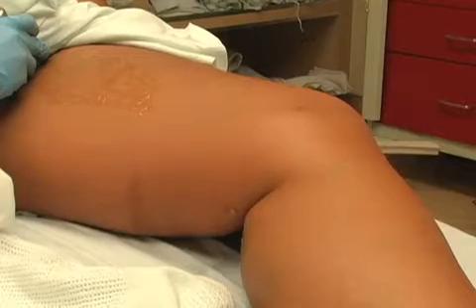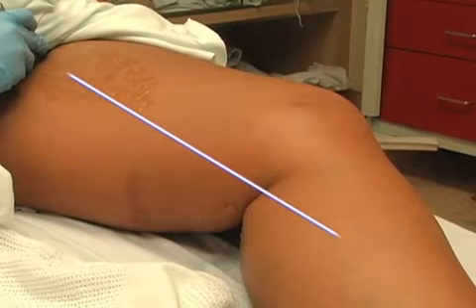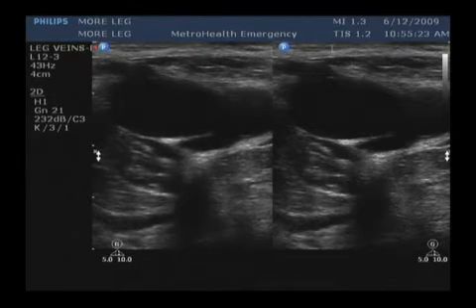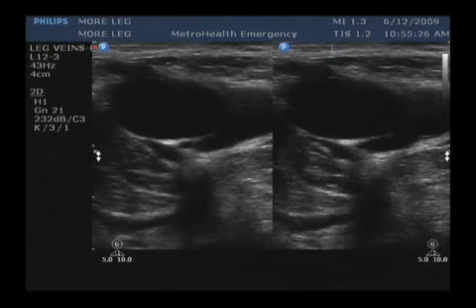A small blush, or the absence of a color blush in the vein, suggests the presence of a thrombus at some point between where the calf was squeezed and the position of the transducer, and should direct you to investigate further for thrombus. Documentation of the study should show both the open vein and its complete collapse at 3 key segments.